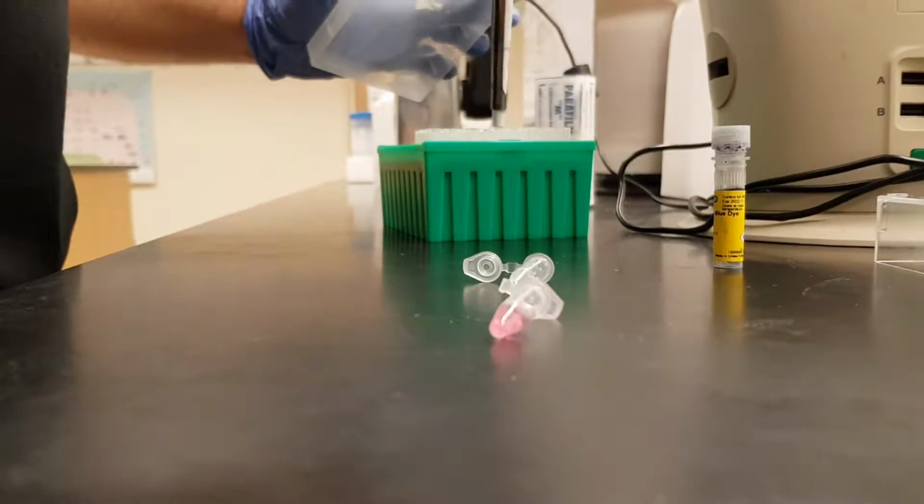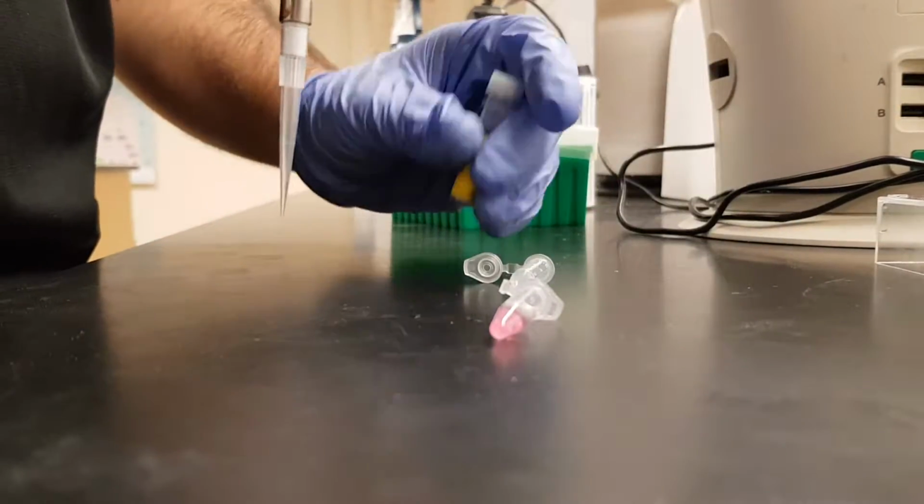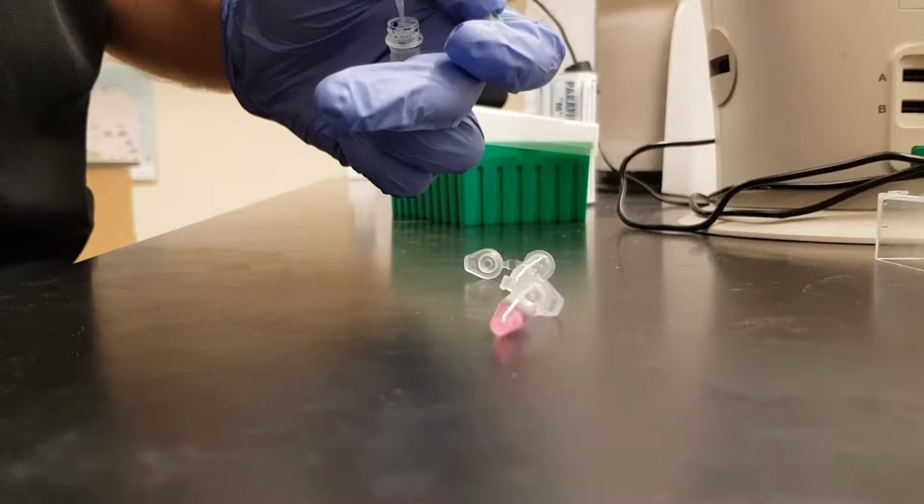Combine both a 10 microliter cell aliquot from the previous tube and a 10 microliter aliquot of trypan blue into another microcentrifuge tube and dilute appropriately.